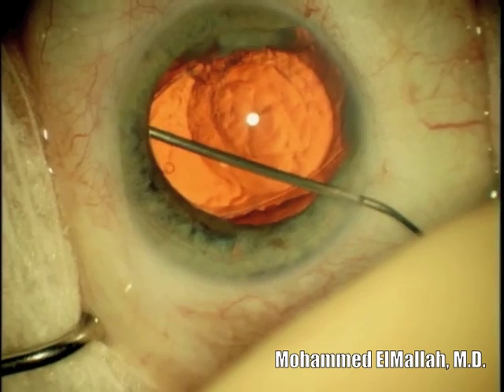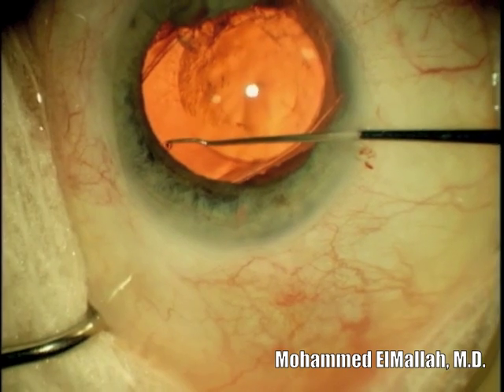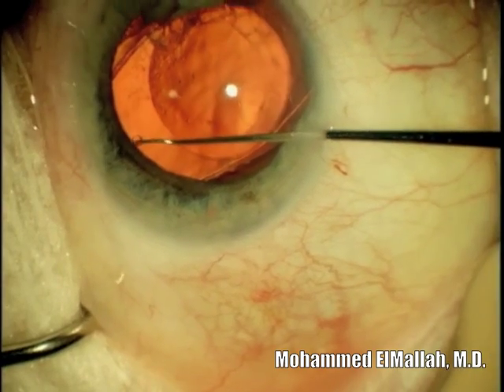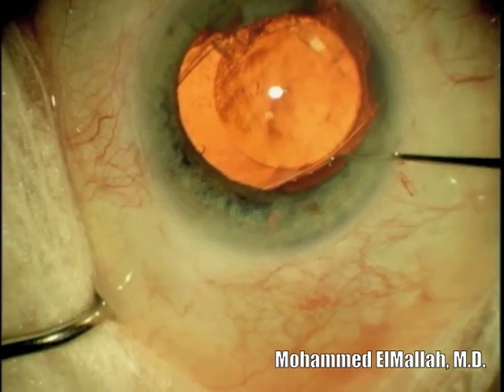Furthermore, the patient had developed uveitic glaucoma. A decision was made to exchange the intraocular lens. First, two side port incisions are created. The anterior chamber is filled with Viscoat.